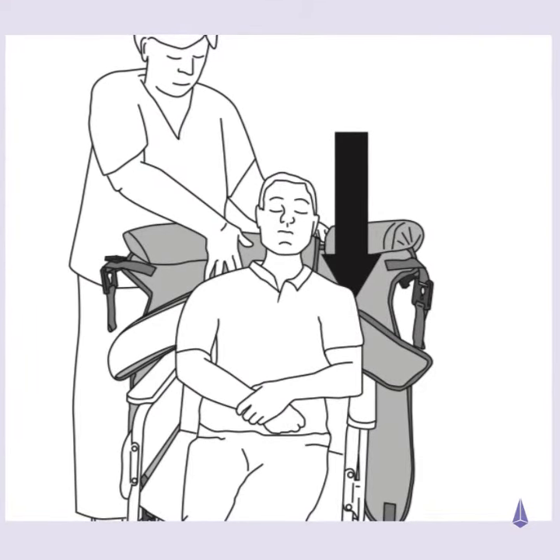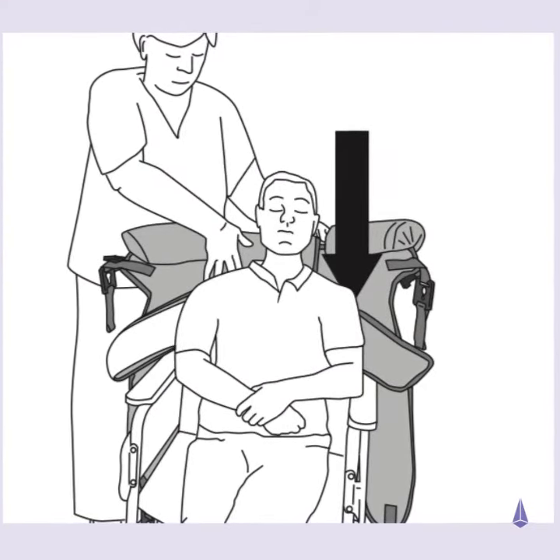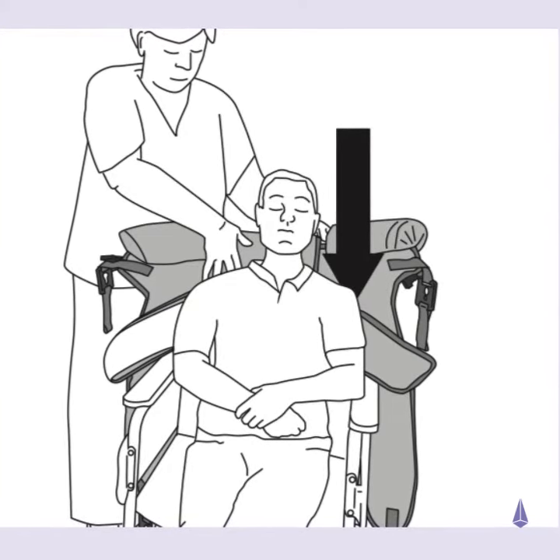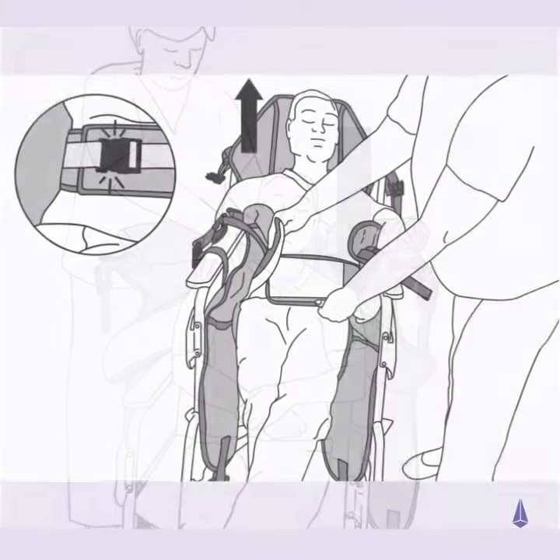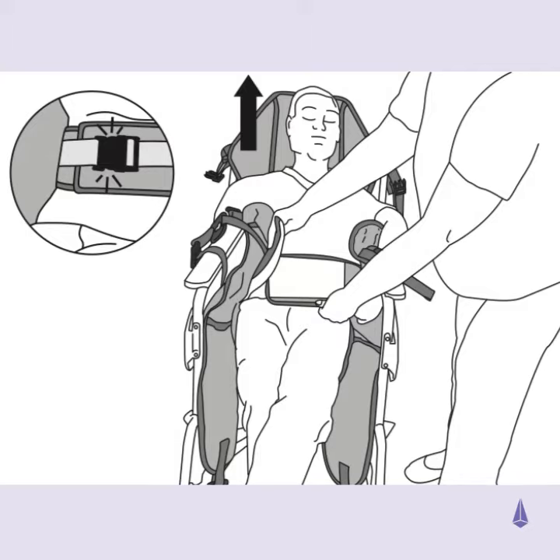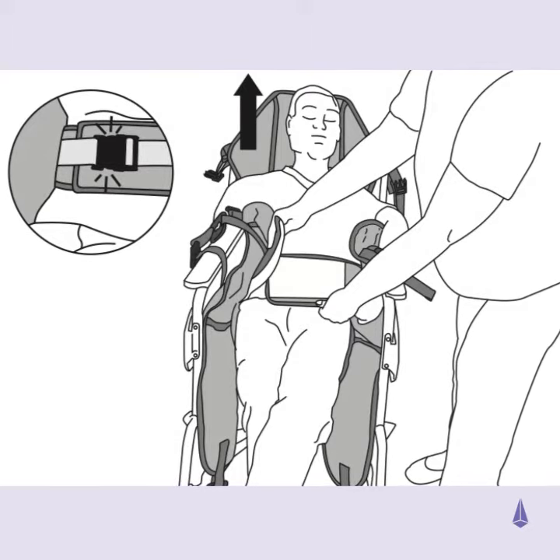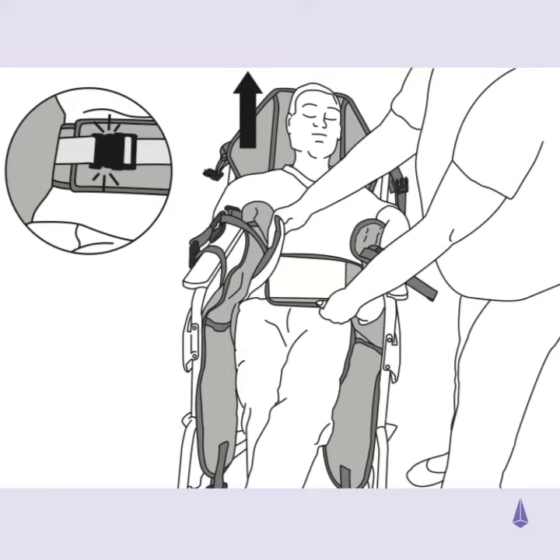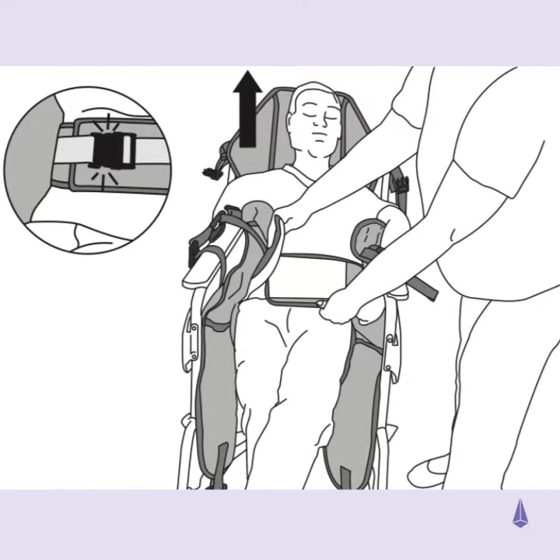With the head support unclipped and the label on the outside, carefully introduce the sling behind the patient. Position the patient's arms on the outside of the sling and close the waist support firmly around the waist. Secure the clunk click buckle and adjust using the webbing strap.